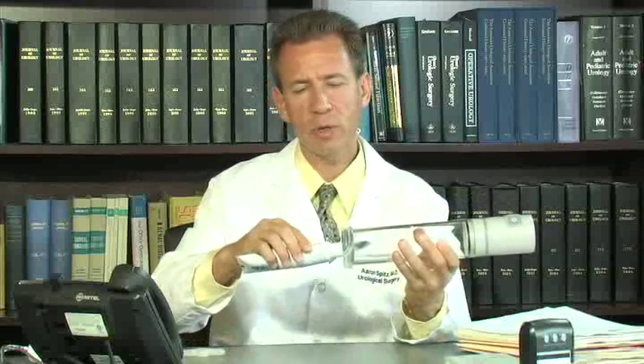The procedure for using the vacuum erection device for use with intercourse is as follows. First, the vacuum cylinder has been prepared so that the constriction band is seated at the base of the cylinder. Lubricating jelly is applied to the inside of the ring so it creates a seal. The cylinder is then placed flush against the base of the penis.